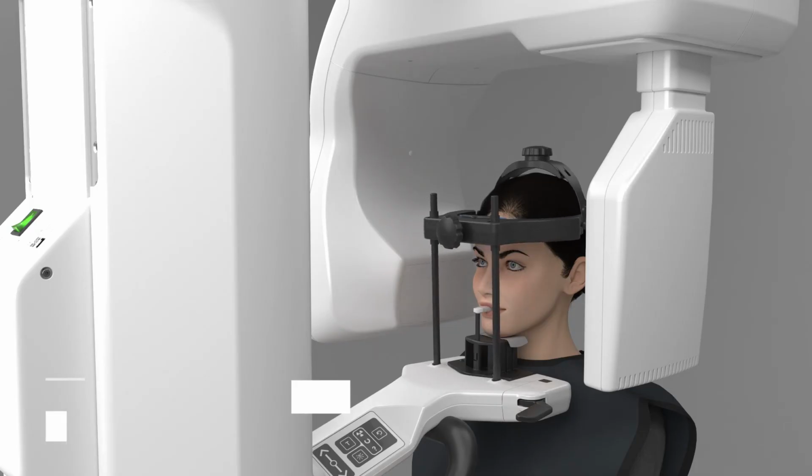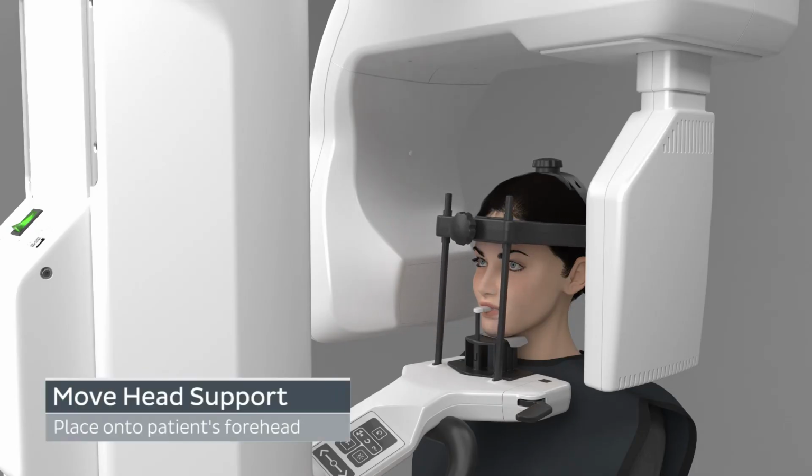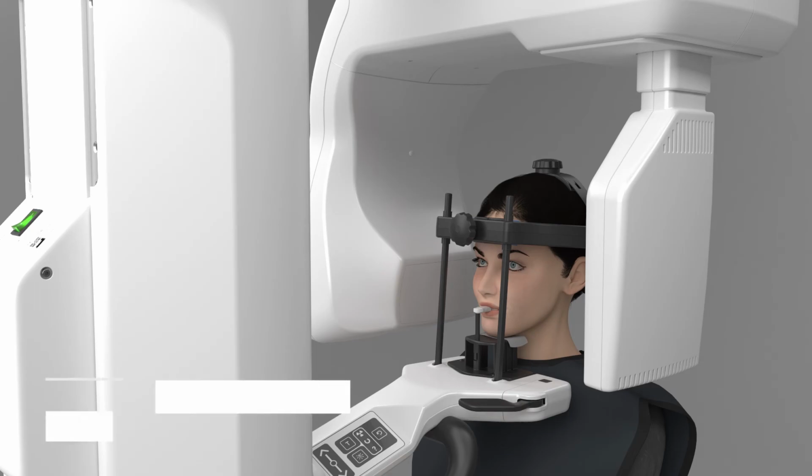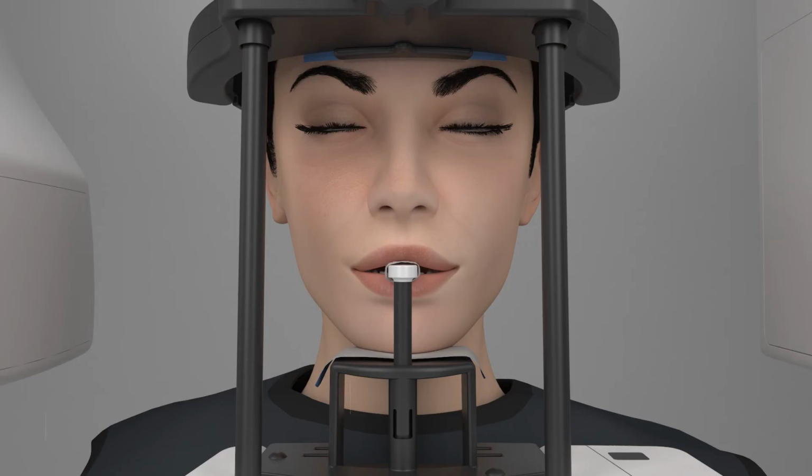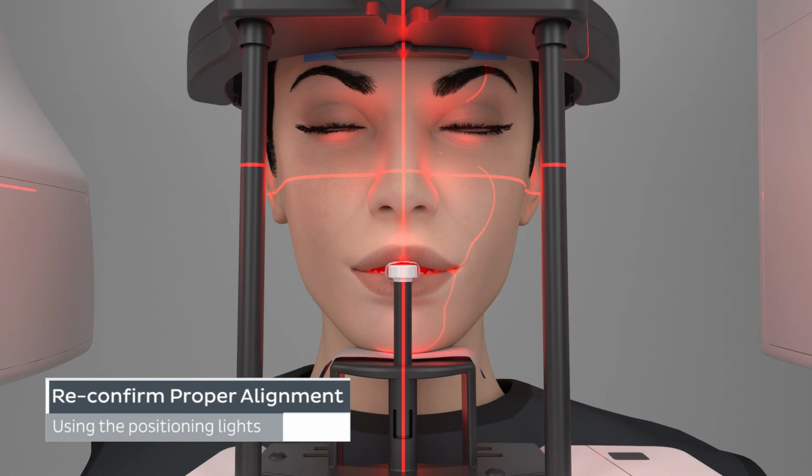Move the head support against the patient's forehead. Adjust the height of the head support if needed. When complete, lock the head support using the locking lever. Adjust the temple supports using the adjustment knob. Reconfirm proper patient alignment using the positioning lights.